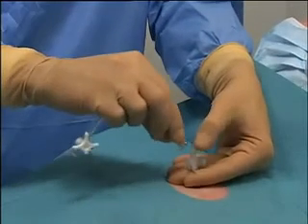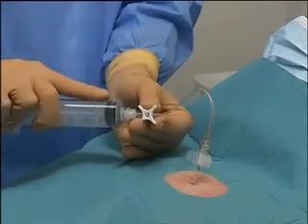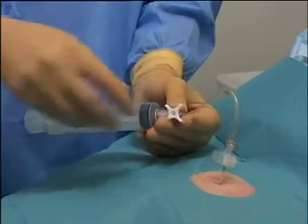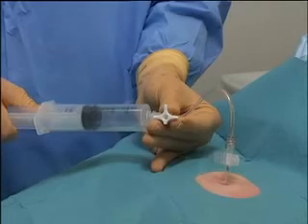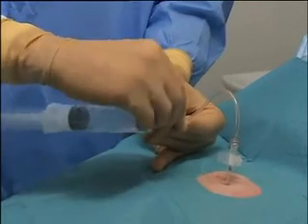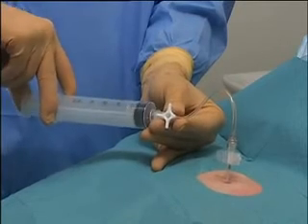Attach the tubing with the three-way stopcock to the catheter. Use the 50 or 60 ml syringe to gently aspirate the air from the pleural space. Evacuate it through the side port into the ambient air.